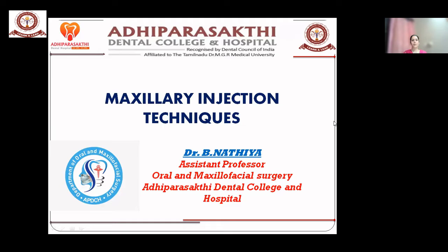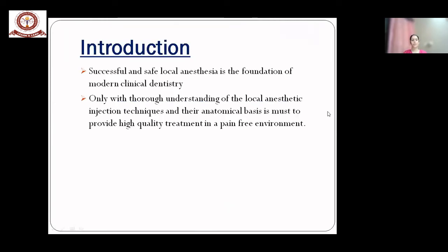Today the topic I'm going to discuss is the maxillary injection techniques. All oral surgical and dental procedures are often performed in an outpatient setting. So local anesthesia is the most common method of anesthetizing the patient. The type of procedure performed, as well as the location of the procedure, determines the technique of anesthesia to be used. So successful and safe local anesthesia is the foundation of modern clinical dentistry.